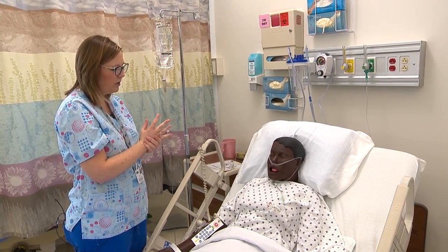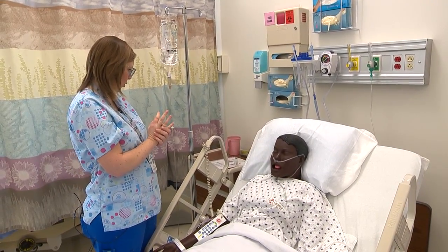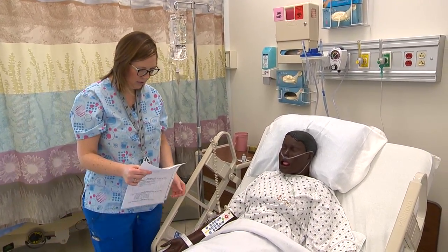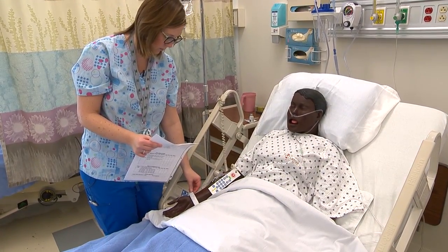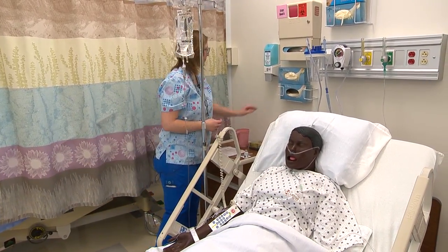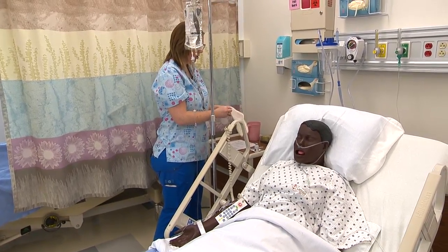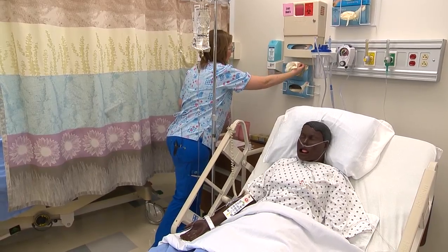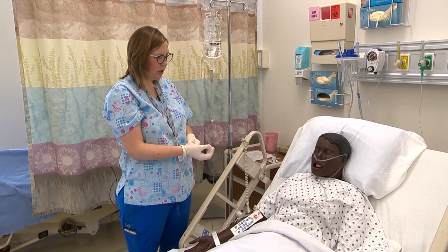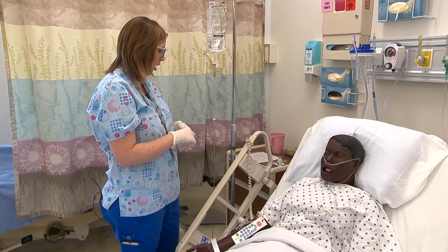I wonder if you're experiencing that chest pain from all that coughing you were doing. I brought some medication for you — it's morphine. Before I give that to you, can you please tell me your name and date of birth? [Patient: Morgan Brown, 8-4-70.] Great, that's what I have here. And you don't have any allergies, Morgan? [Patient: No, I don't.] Your pain should decrease and you should feel better after I administer it. If you feel uncomfortable, get any itching, or notice any problems breathing, use your call light and call me right away.